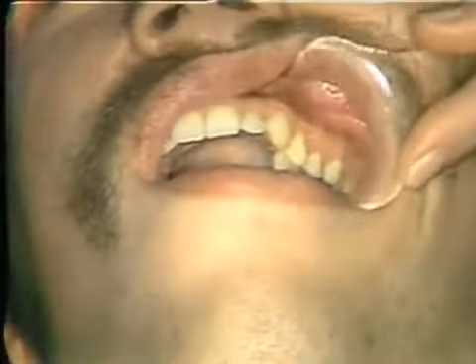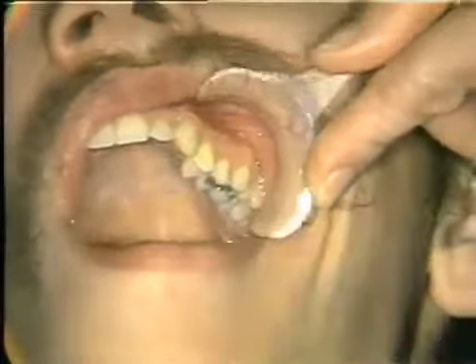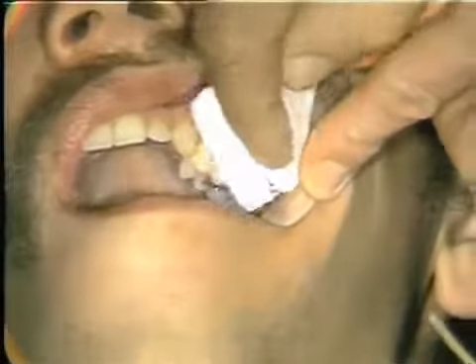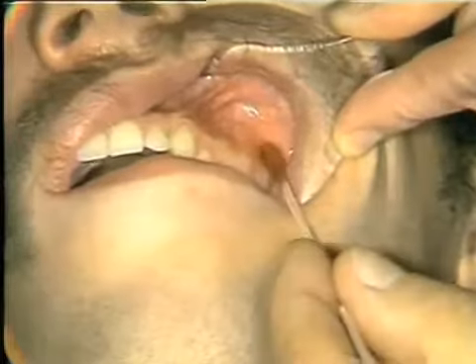All right, let's see if we can show it nicely here on the patient. Again, we're using a retractor, which normally isn't necessary, just so you can see a little bit better. First we'll dry our mucosa, and you might close just a tiny bit. At the same time, I'm palpating the malar strut. I know where it is, about here at the second molar. Then we'll use a little betadine again, as usual, in our injection site, well out in the vestibule this time.